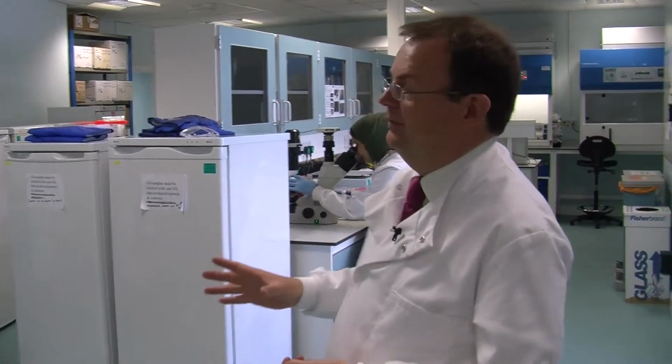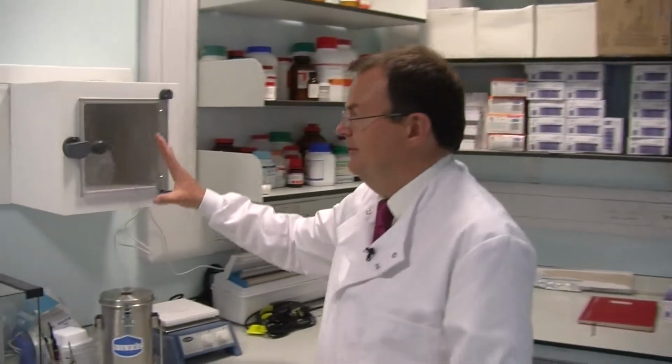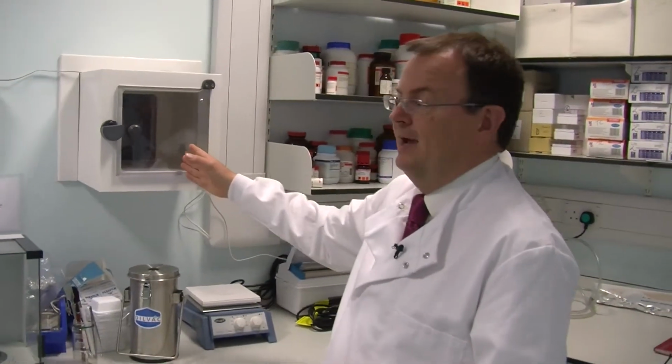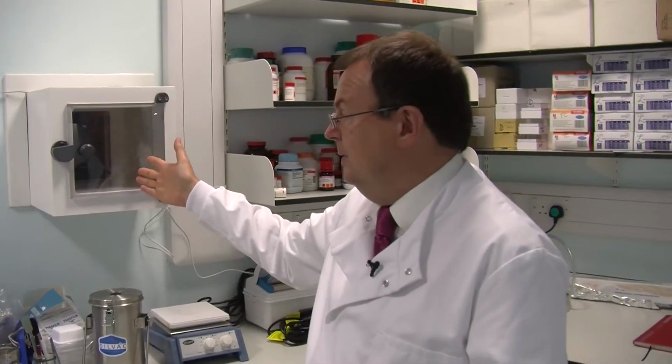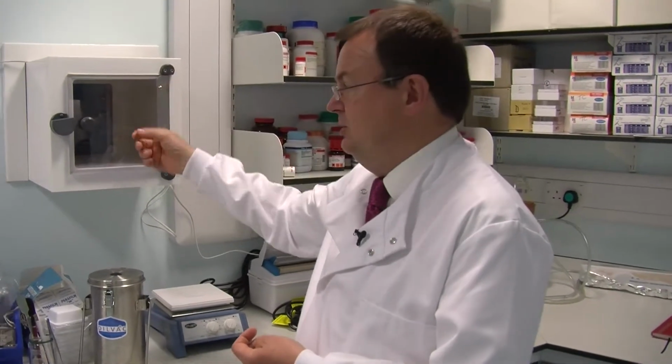So this is our cell and tissue engineering laboratory. Essentially, it's for the culture of living cells, and while it perhaps looks a little bit impressive at first, the components are relatively simple. Over here is where the cells arrive into our laboratory. Generally speaking, we may have waste tissue from surgery, we may have animal parts from the abattoir that we've collected, where we're basically recovering the living cells so that waste can go away from here, and from the room behind this little airtight hatch, in will come the cells, hopefully in a sterile state.